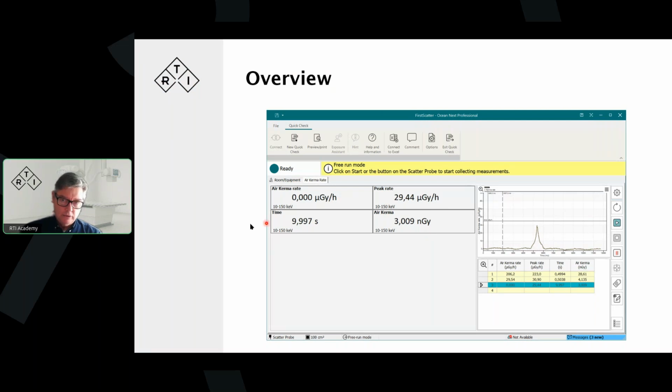You need to decide what you're measuring and what you're trying to detect. Maybe we're picking up a peak, but it may not even register in the accumulated dose. So those are two different things.